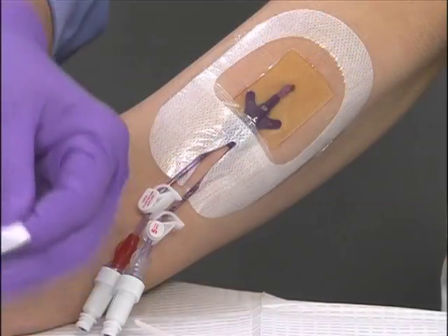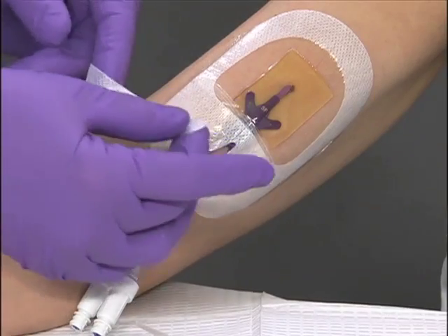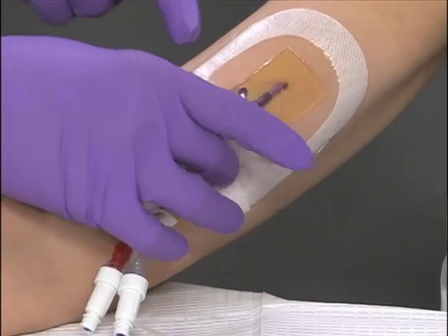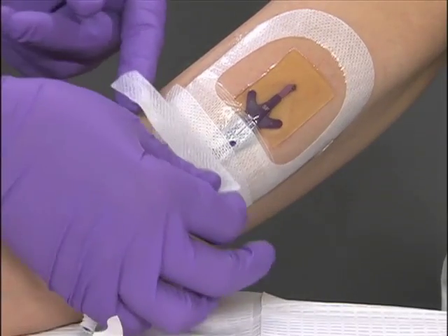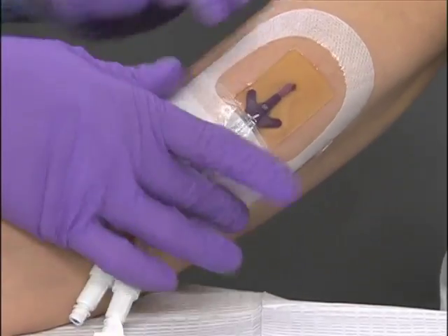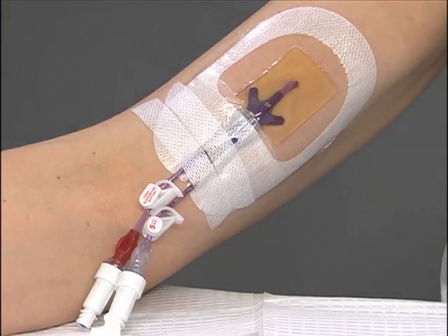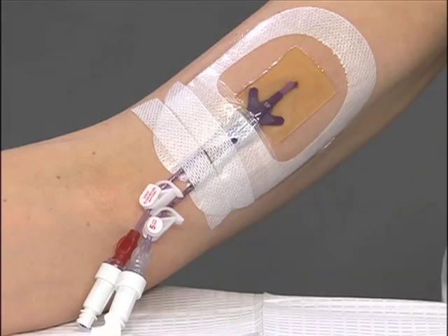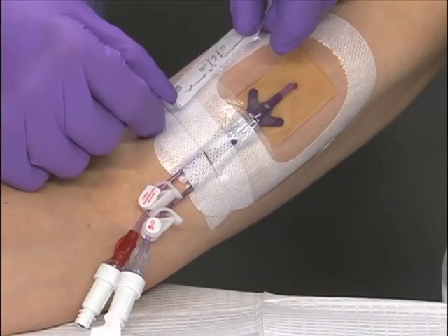The 1657, 1659, and 1660 dressings include 2 tape strips. Use them to further secure the hub or tubing of the catheter. Document the dressing change information on the pre-cut label. Secure any catheter lumens. The dressing is now complete.